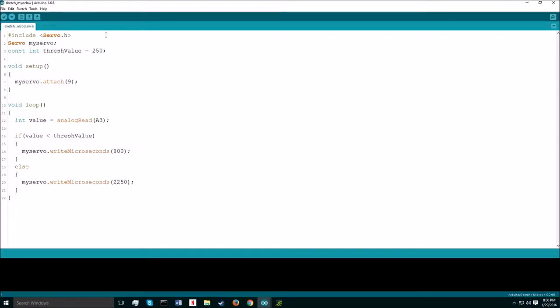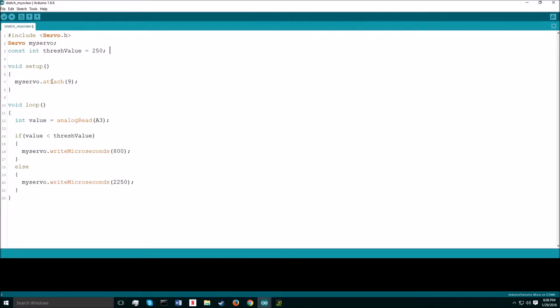Here is the program that I wrote to work with my Myoware circuit. First, I included the servo library. Then, I named my servo. Then, I created a constant integer value called thresh value. I'll go more into what this does in a second. In the setup, I attach my servo to pin 9 in the Arduino board.